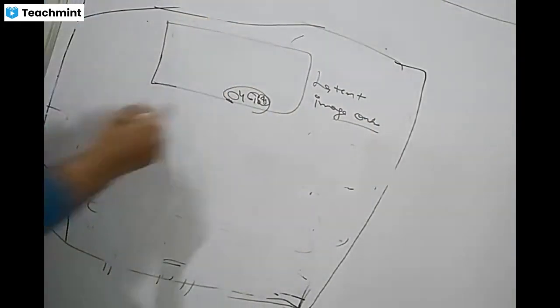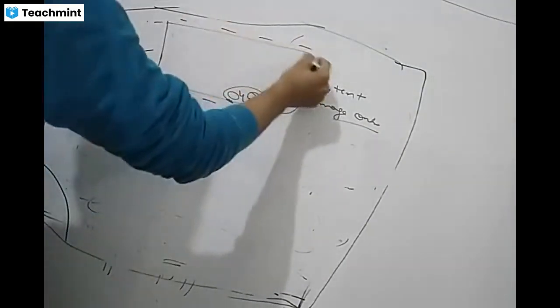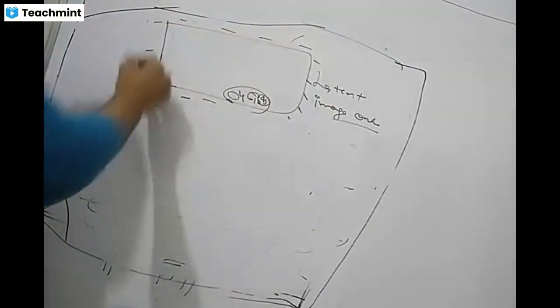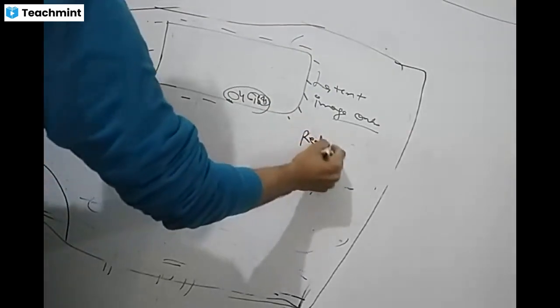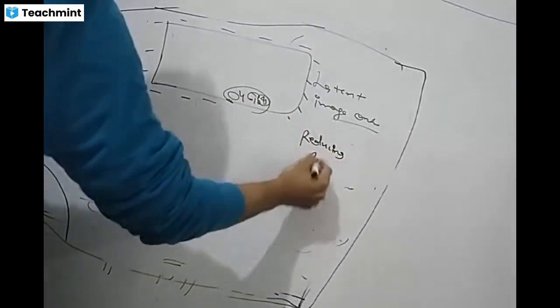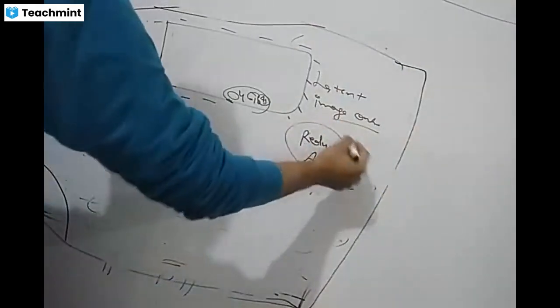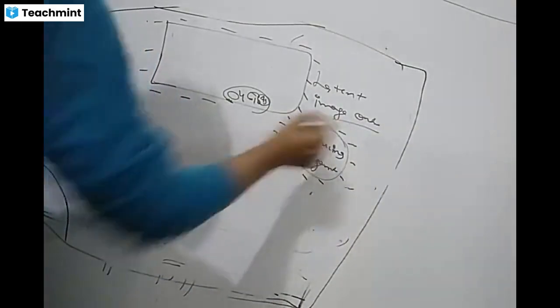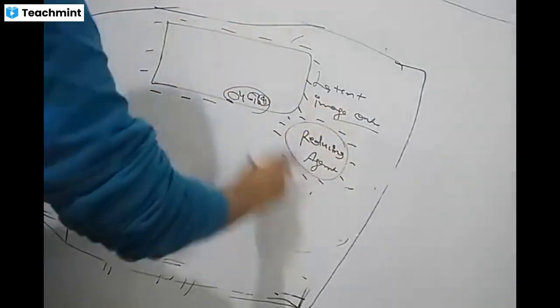One crystal has negative charges on this side. The developer has one component, the reducing agent. This reducing agent also has electrons. So this surface is negative and this is also negative.